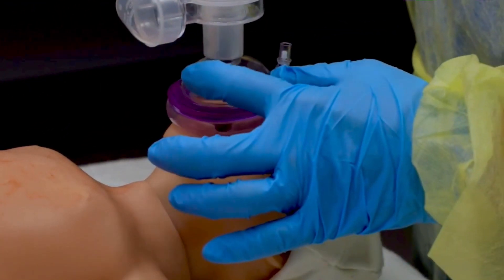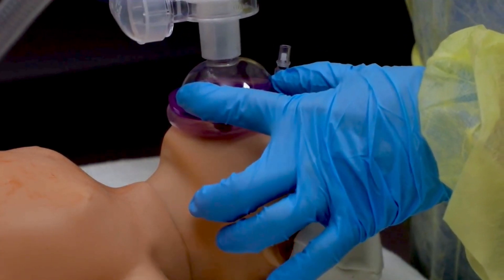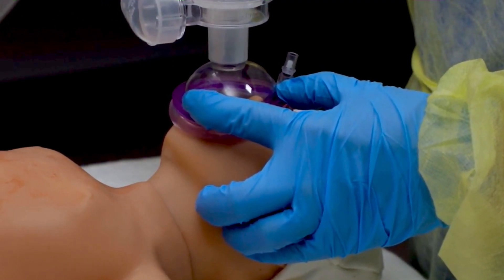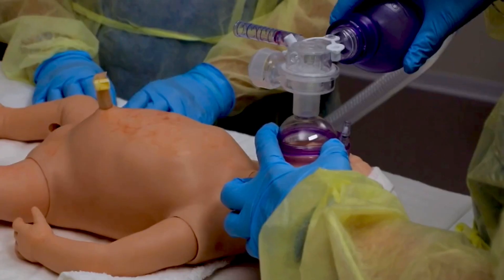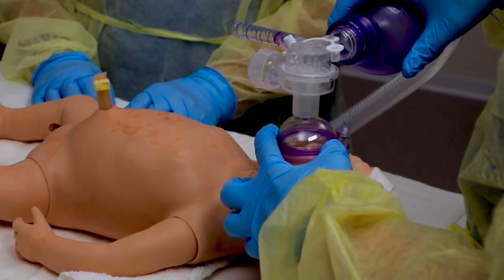Encircle the rim with your thumb and index finger. Your other fingers are under the bony angle of the jaw. Do not push the mask down on the face. Lift the jaw up toward the mask. Put gentle pressure on the rim of the mask to form a seal and hold the head in sniffing position. Don't rest your hand on the baby's eyes or compress the baby's neck.